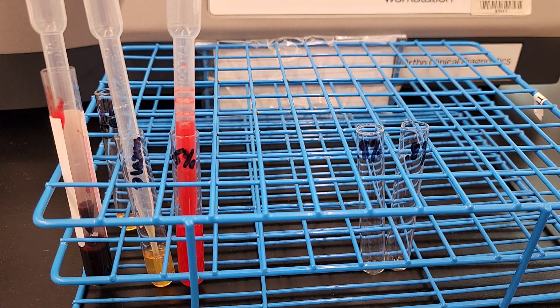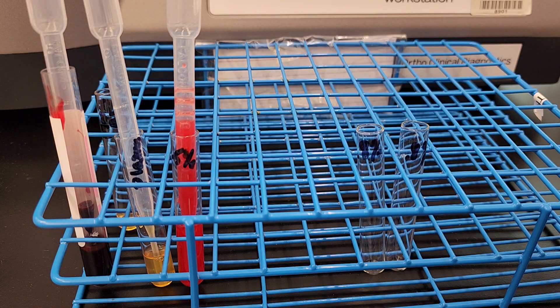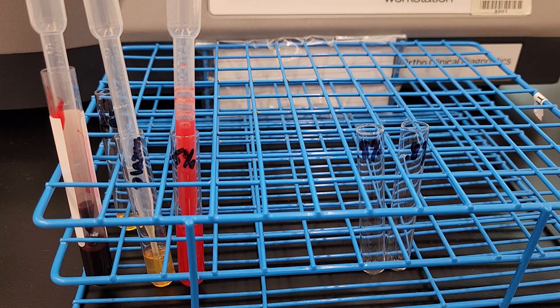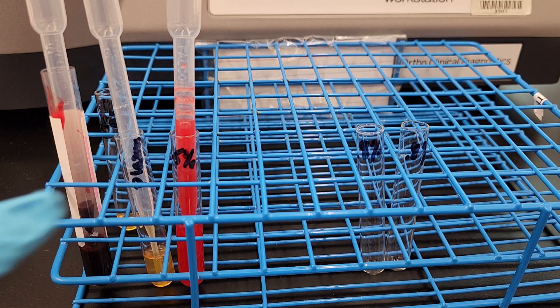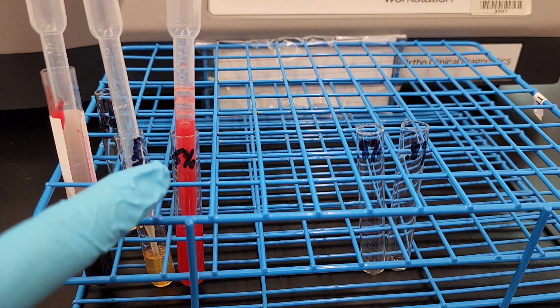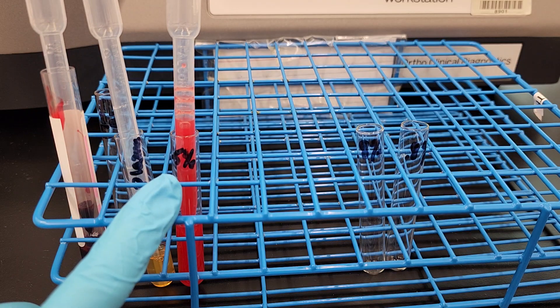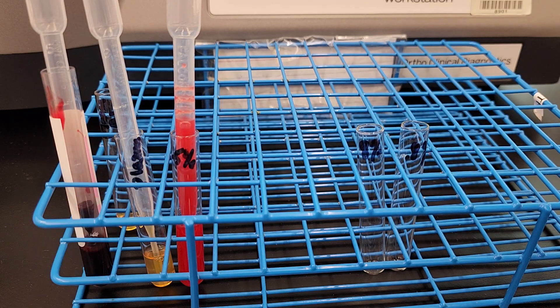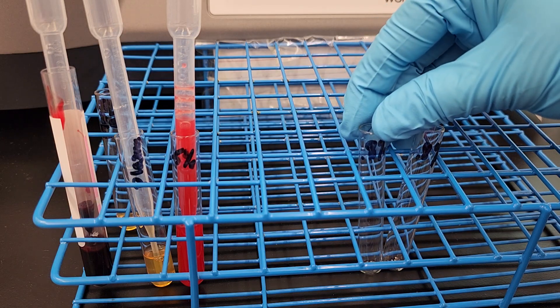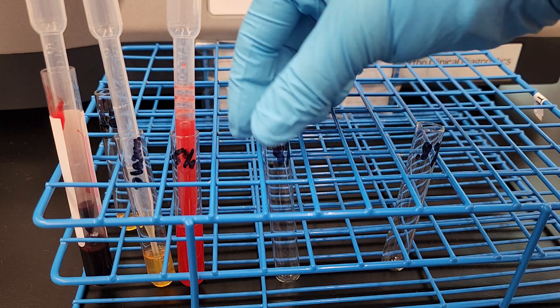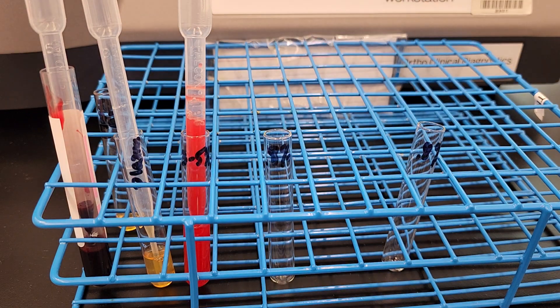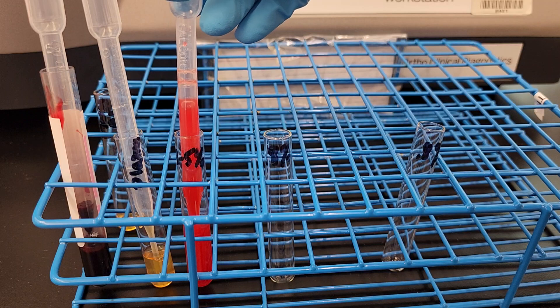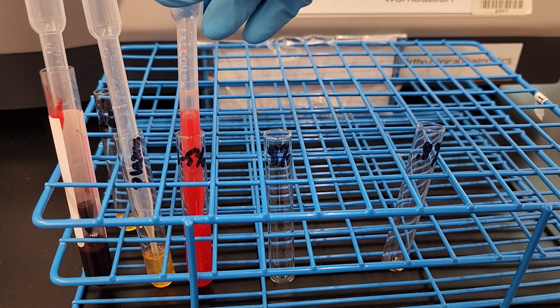So what we do in our lab is we do tube testing for blood typing every time. The gel cards are super expensive to buy for the blood typing. So we always go with tube. So since that's the case, and that's the first part of required testing by AABB, then since you already have this made, what we can do is make a 0.8% cell suspension from your 3 to 5%. And that kind of saves you a step, maybe, because you know this one's already really good. So I'm going to show you how to do that.